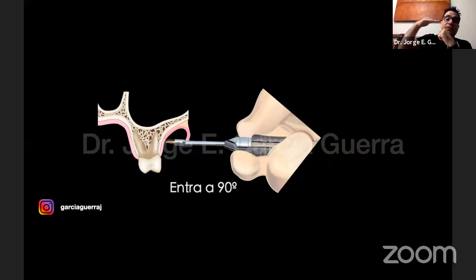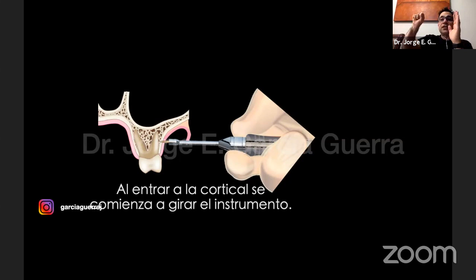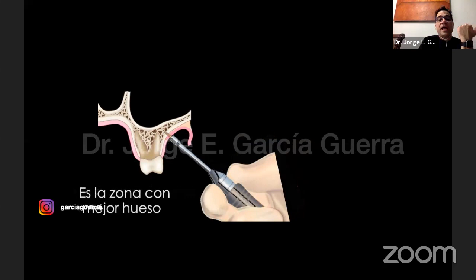You can see there, it looks like a different pink color. Once you cross the cortical bone, as you start moving your instrument, you're going to start changing the direction. We're going to try to look between 60 and 70 degrees. We're going to angulate it so it goes exactly where we have the best bone thickness. When you see it the first time, it looks very unreal, like how you're going to bend the instrument inside of the patient's mouth. But we're just bending it in the cortical bone.